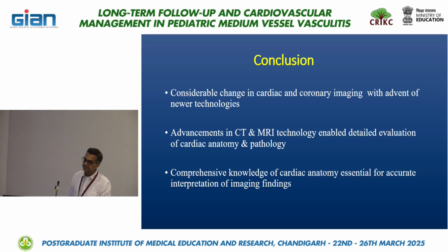So I think then the morphology of the aneurysm, saccular versus fusiform, as you follow them, you can see stenotic lesions, you can have calcifications.